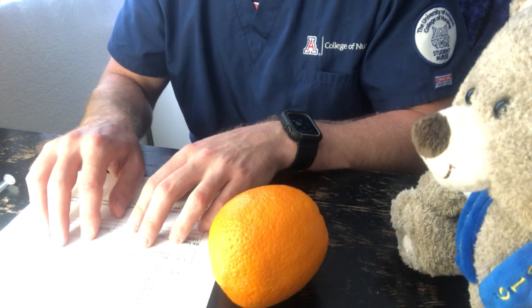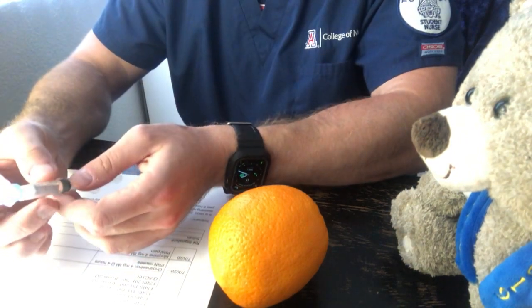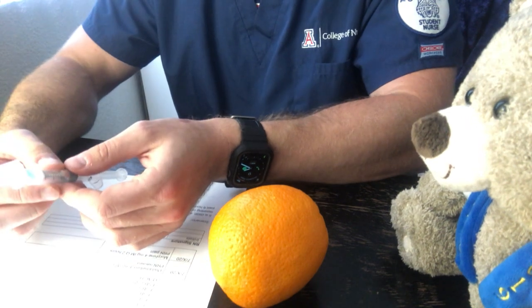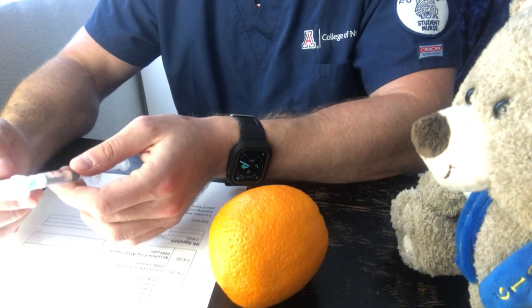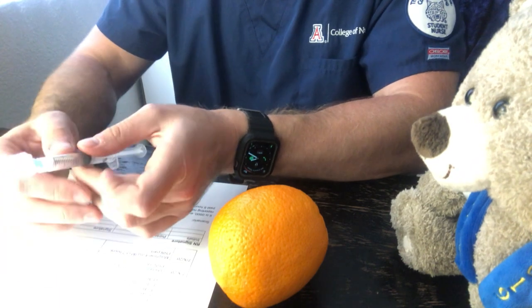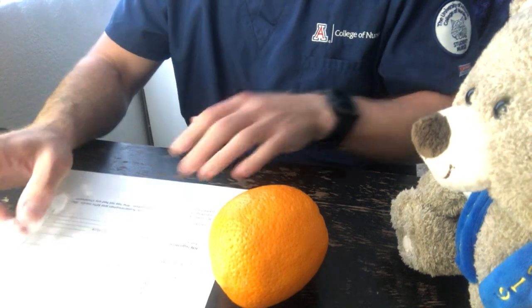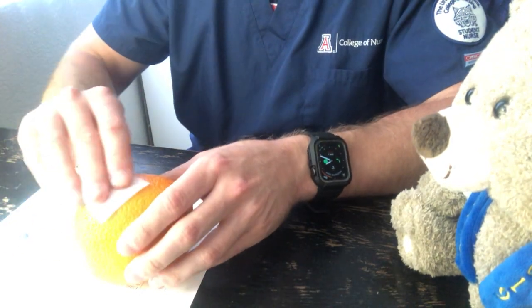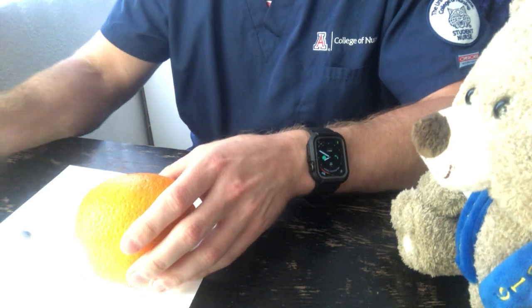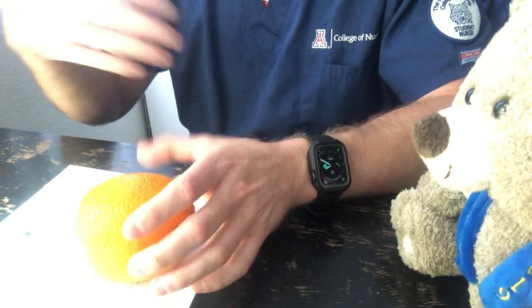IM. And since it's 2 mLs, I'm probably going to give it in a big muscle, most likely below the waist. You could also give it in the deltoid. But probably I would give it in the vastus lateralis or the ventrogluteal. As I said, the only other one I would probably do is the deltoid. So again, I have my patient. I'm going to scrub with an alcohol wipe for 15 seconds. Again, I have gloves on. I'm going to allow it to dry.